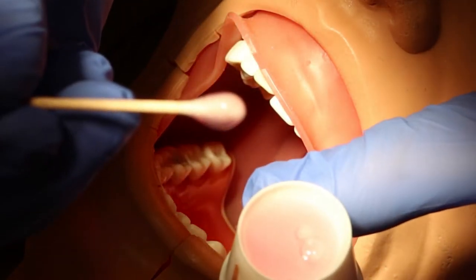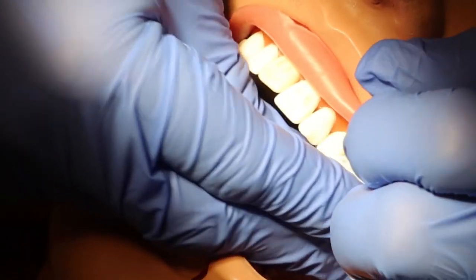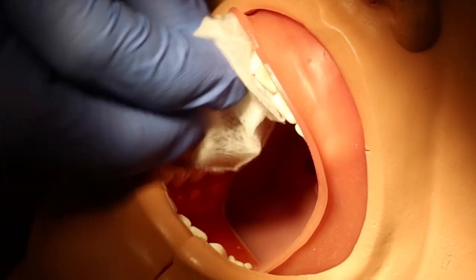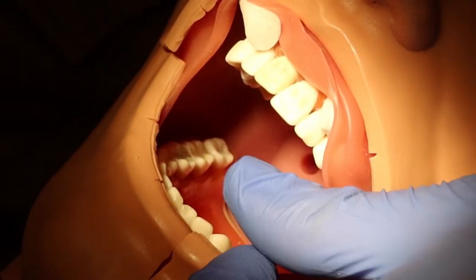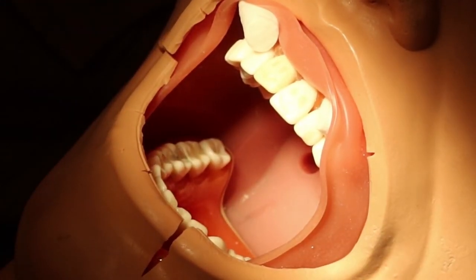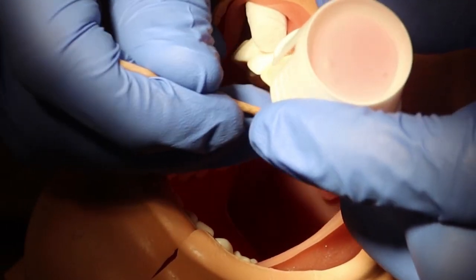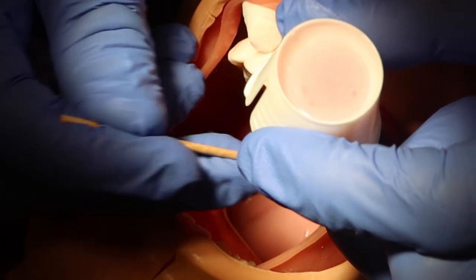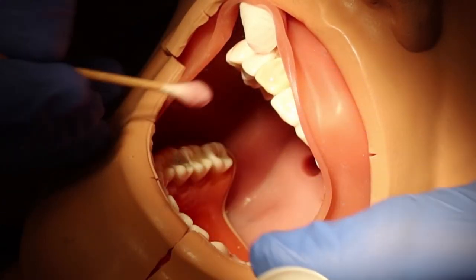Using one of our cotton tip applicators, before you start applying, make sure that the teeth are as dry as possible. You can hit it with either a 2x2 gauze and give it a gentle wipe, or you can hit it with our air-water syringe to get a nice little breeze going on and get those teeth dry. Once they're dry, keep some isolation tools going — go ahead and start packing cottons right in the anterior region right where the gum tissue would be, so the tissues don't touch the teeth and it keeps them off of the fluoride. Then go into application style and paint it onto the teeth. You're still getting that same application. The only thing you need to worry about is making sure your patient still does not swallow it, so don't lather it on as much as you normally would with the tray method. You'll still have that perfect one to two minutes depending on the manufacturer, and don't forget to get into those occlusal surfaces on the posterior teeth.